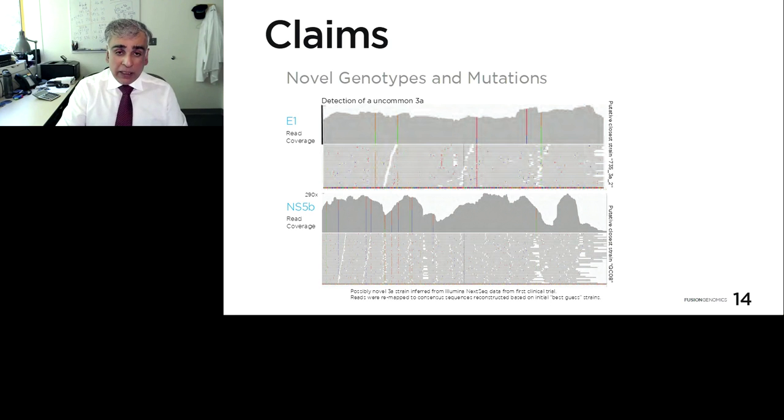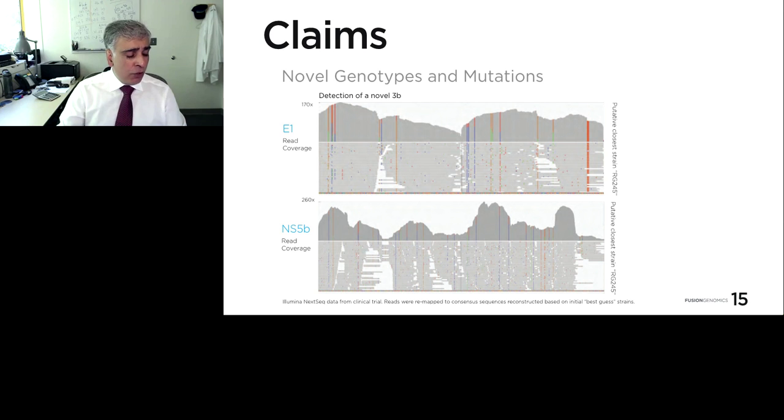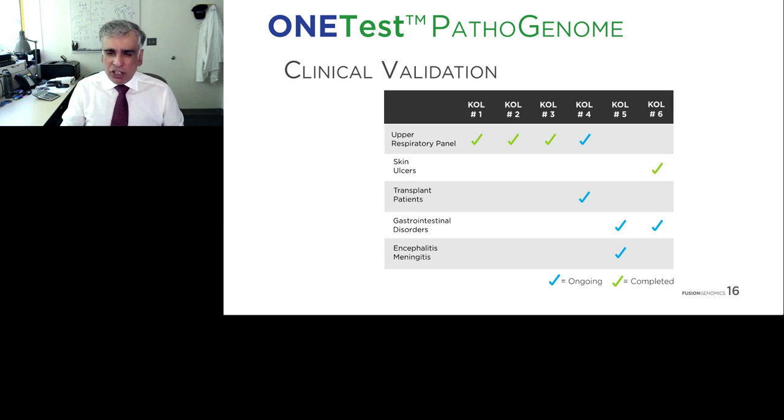Moving forward. Okay, so far the data we discussed was largely coming from single organism studies, whereas the intent of the assay is to be massively multiplexed. Now, you would agree with me that yes, we are designing the assay against all known pathogens, but it's virtually impossible to test them against all known pathogens. So the approach we have taken here at Fusion Genomics is to test them against both clinically challenging situations as well as scientifically challenging situations.